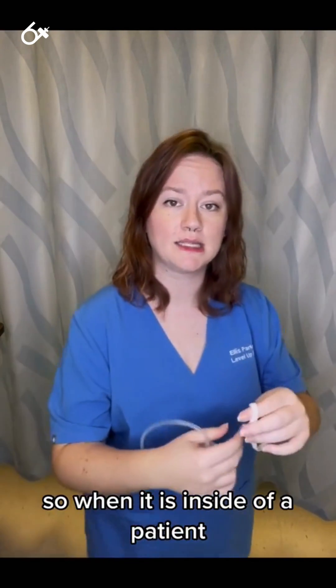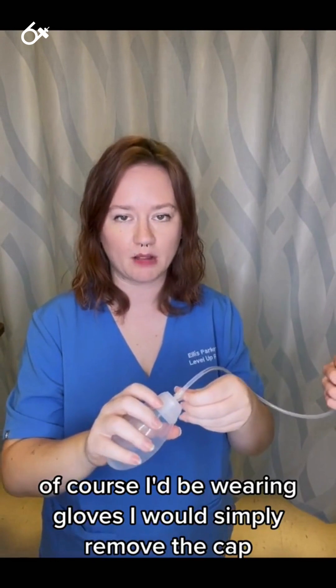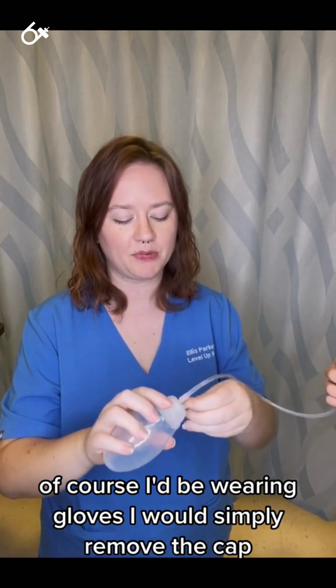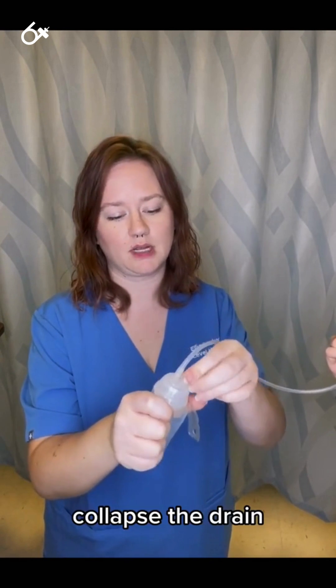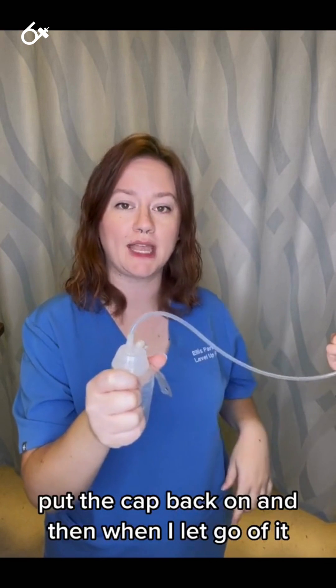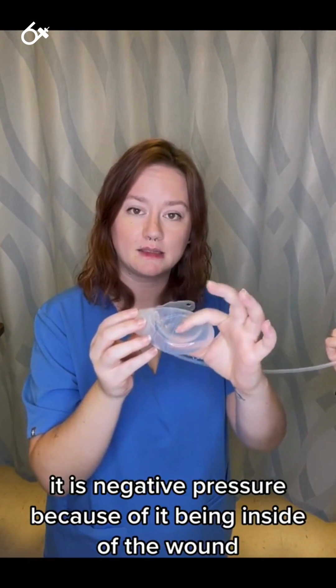So when it is inside of a patient and there is pressure applied — of course I'd be wearing gloves — I would simply remove the cap. I would empty it if I needed to, but I need to collapse the drain, put the cap back on, and then when I let go of it, it is negative pressure.